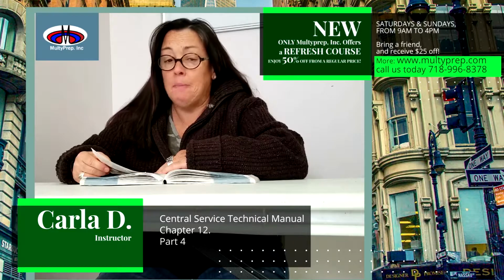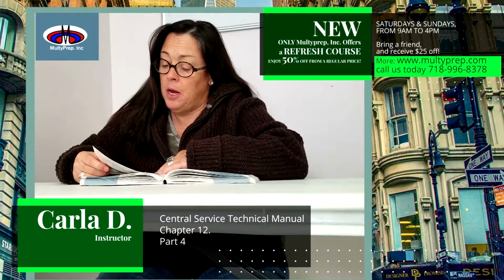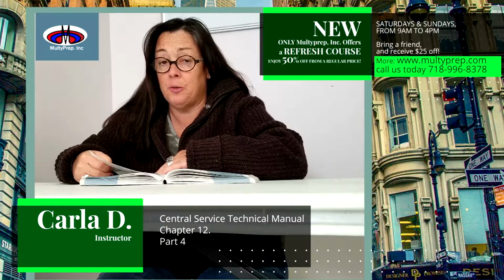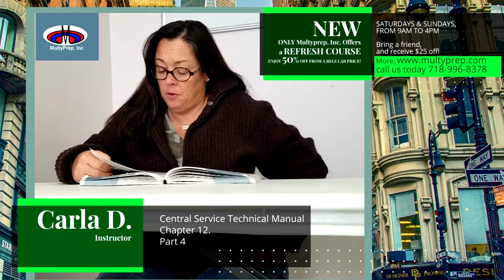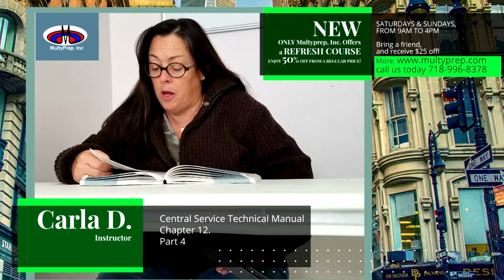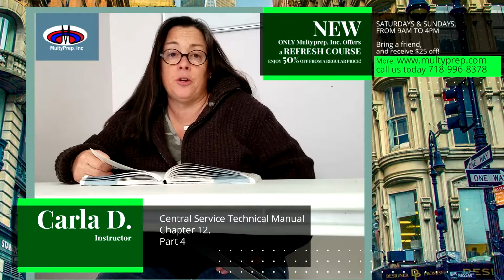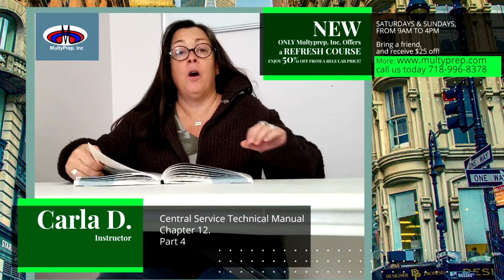Papers are commonly used as sterilization packaging materials. It is important to ensure that the paper packaging is intended for use as sterilization packaging and that it has been approved by the FDA. Note: papers containing cellulose cannot be used in hydrogen peroxide or ozone sterilizers because cellulose absorbs the sterilant and reduces penetration. As this occurs, the contents being sterilized may not be exposed to the proper amount of sterilant.